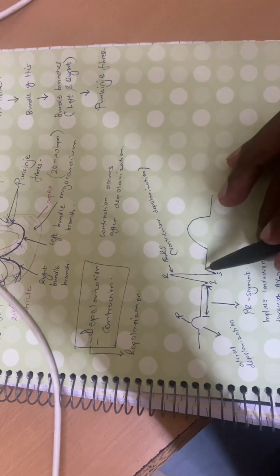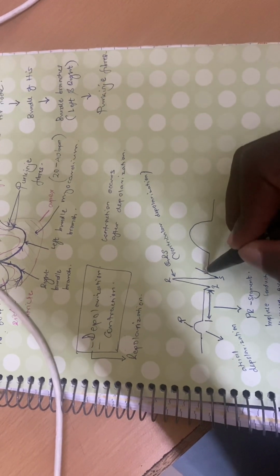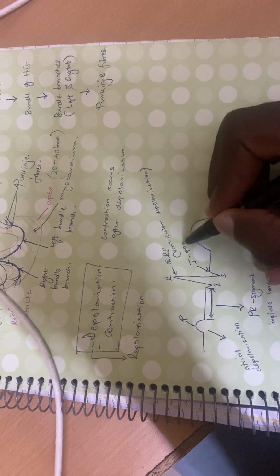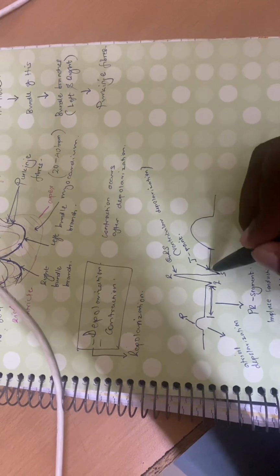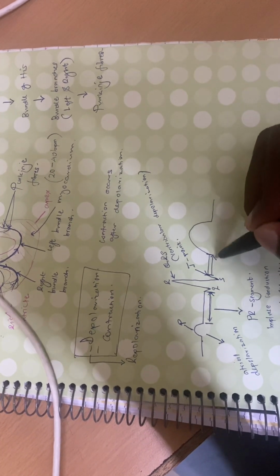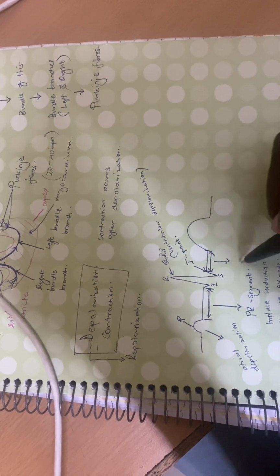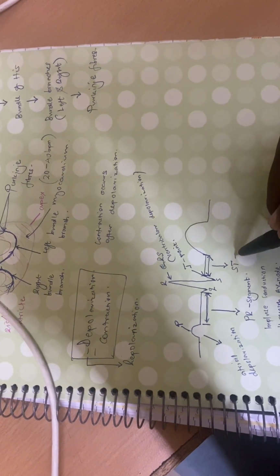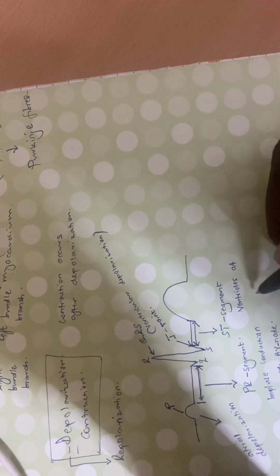So, next, after ventricular depolarization, there comes a point called J point. That is the end. And now there is this segment here. This segment is called ST segment. What does it indicate? It indicates ventricles at full depolarization.